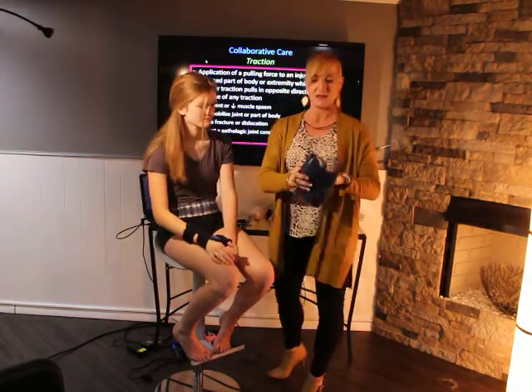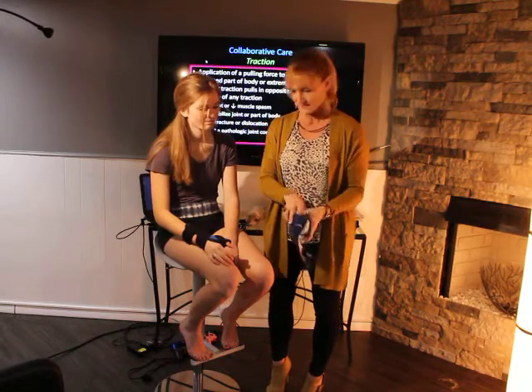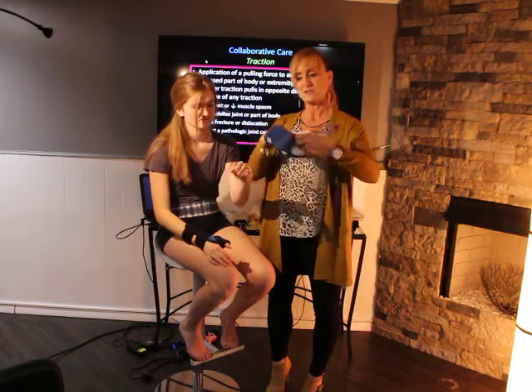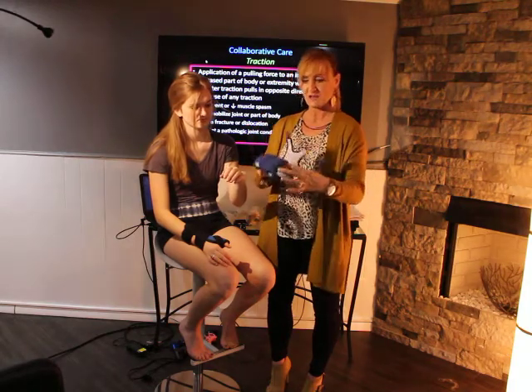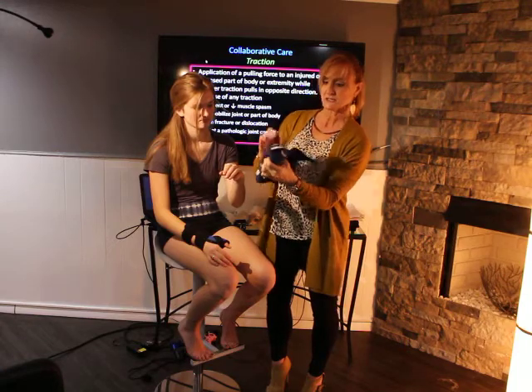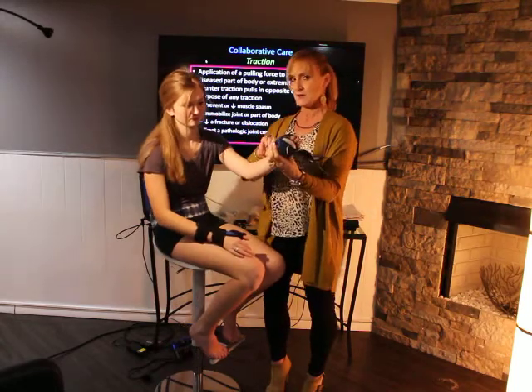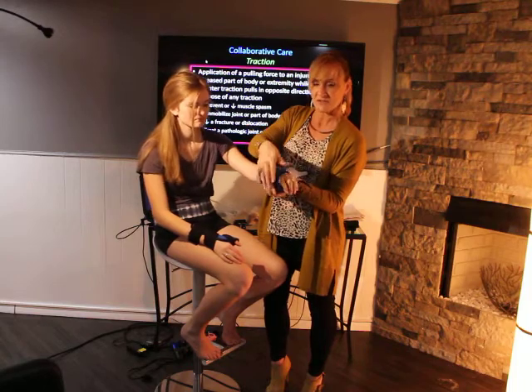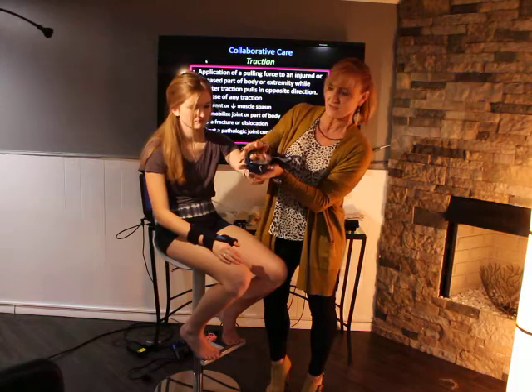Sometimes if your patients come in and have a more significant injury, for example, let's say you want to immobilize their entire wrist because you've got a big wrist sprain, you can use something like this. If you'll notice, on the inside it's nice and cushiony, there's a lot of cushion at the top, and ones like this are ergonomically really nice for that inside hand. So you're going to have your patient put their hand in here. This might be a little bit uncomfortable, especially at first, because the patient is going to be in pain. But again, there's a spot for the thumb. The nice thing here, lift those fingers up, there's a spot that these can rest right on that cushion.